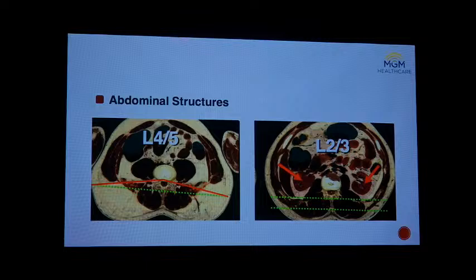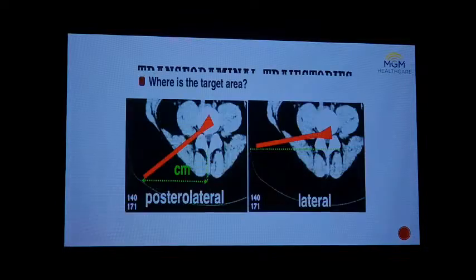People keep asking, after doing an MRI, why do you want an X-ray? We use the X-rays both for orientation intra-op and for pre-operative planning. Based on the pathology, whether the fragment is predominantly within the canal or in the central part, like discitis, we use the angles. We have to go steep, or be very shallow in the access.